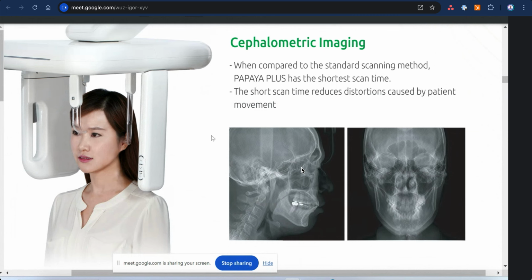This is needed when I want to do orthodontic treatment, for example, to get things straight. What is the problem? Is it in the teeth or the bone that holds the teeth? Sometimes the teeth are positioned correctly, but the bone is not in its correct place. So instead of putting wires on the teeth, I put a device that can fix the bone itself. This is what it can mean.